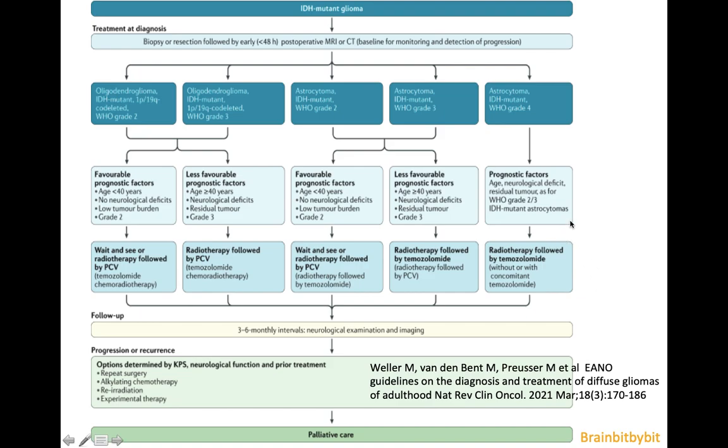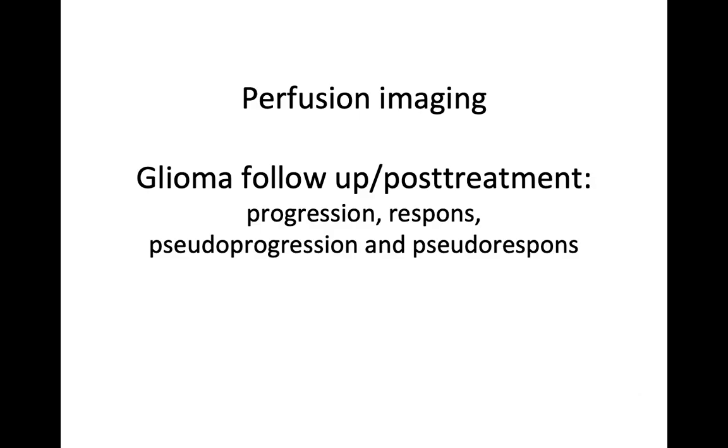And if you look at this scheme, it has become very complicated nowadays. And we do a lot of imaging in tumor follow-up. So in the next vlogs, I'm going to talk about perfusion imaging and post-treatment gliomas.